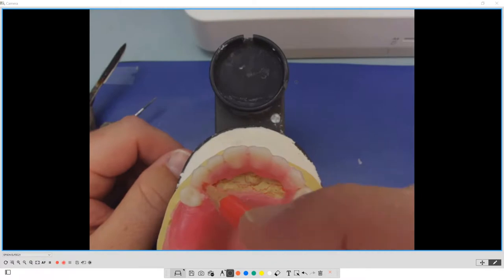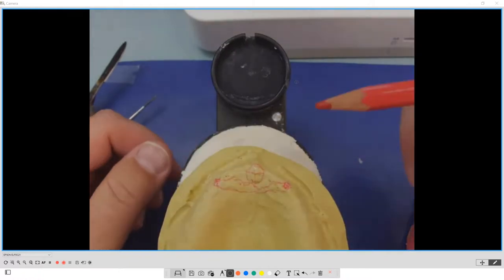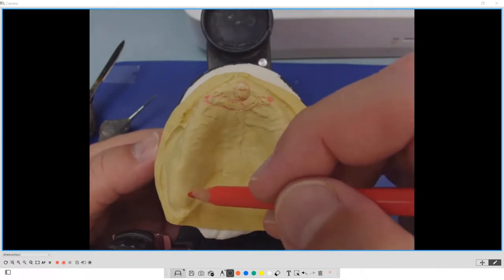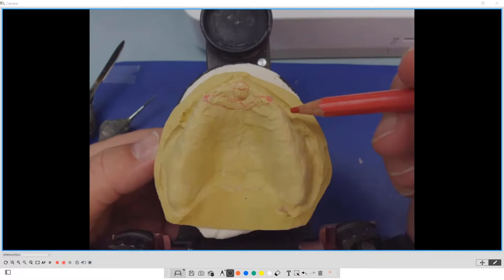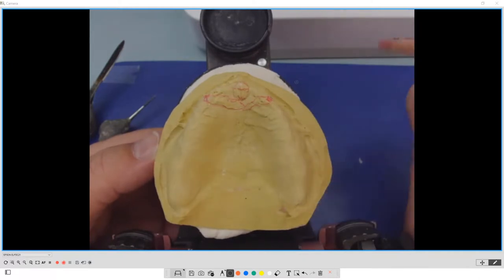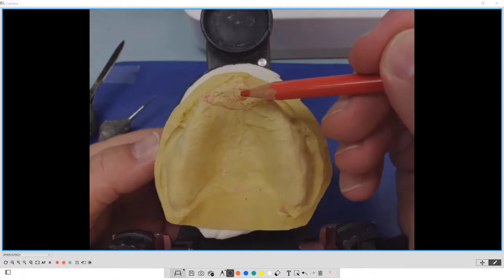That's why we know that the rugae shows us again where the cuspids are. And now that we're jumping into digital technology, that's part of a model analysis, because model analysis becomes really important digitally, because we have to tell the software where to put the teeth. So we're using these anatomical landmarks that they're using for pinpoints, based on anatomic landmarks of the person's ridge, to be able to set the teeth in that. So that's how the software developers had to write the software. And now that's why you're seeing digital technology come with the model analysis component.